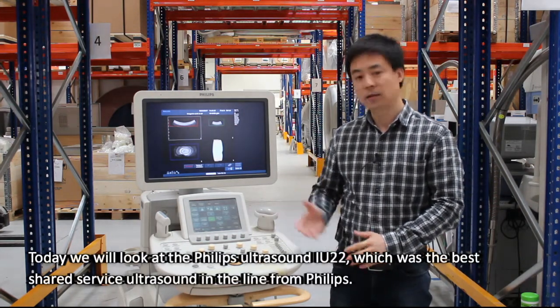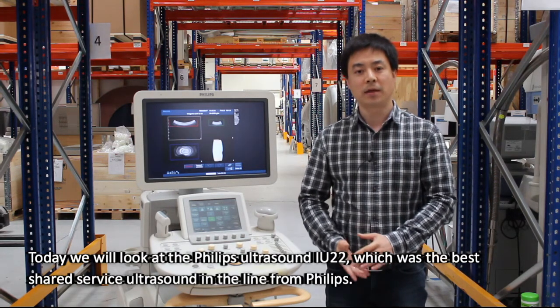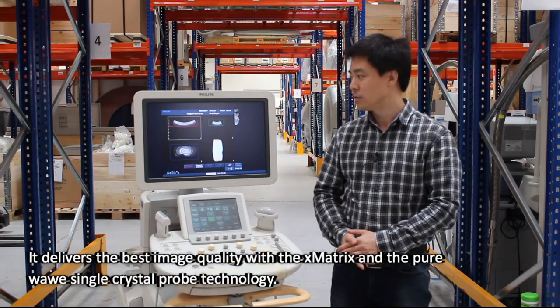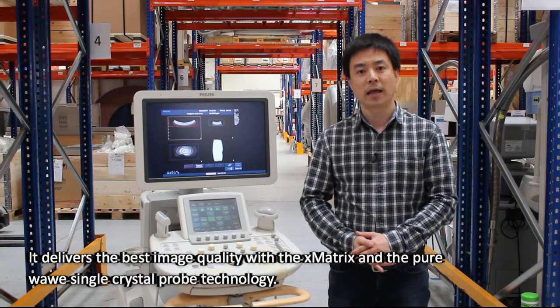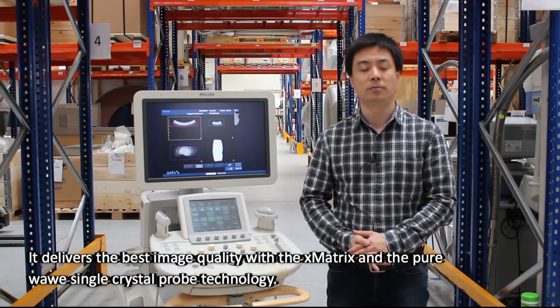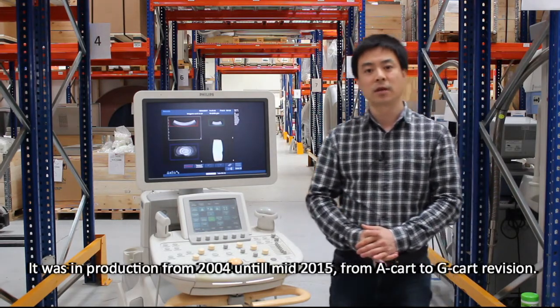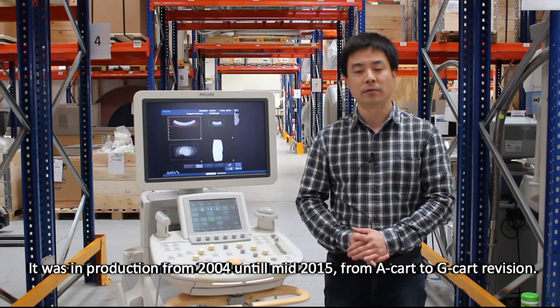Today we'll look at the Philips Ultrasound IU22, which was the best shared service ultrasound in the line from Philips. It delivers the best image quality with the xMatrix and the PureWave single crystal probe technology, and it was in production from 2004 until mid-2015, from A-cart to G-cart revision.